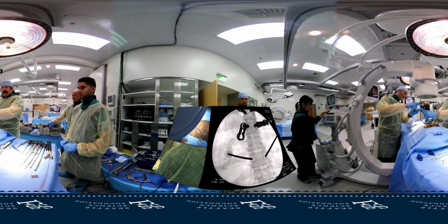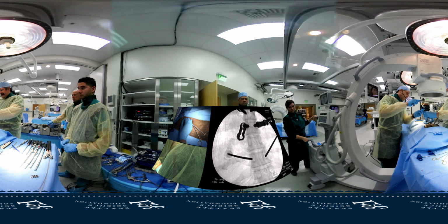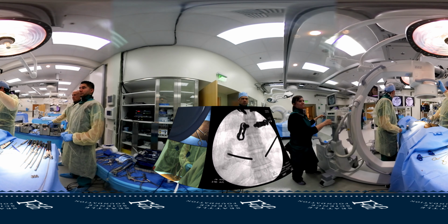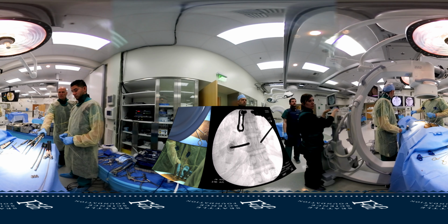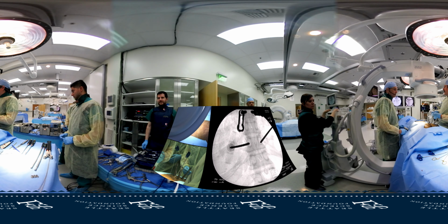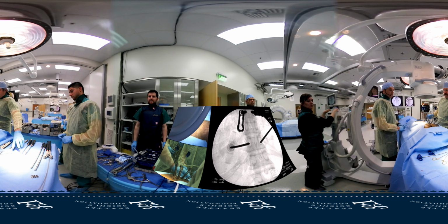Go ahead and move north a second so we can tap it in. Go ahead. That's good. Stop right there. Come down. And so I'll put it in about halfway to my mark. Picture. And you can see I've still not hit the medial border on the fluoro. If I cross that medial border, is it possible to see up on the fluoro? Let me see a marker.